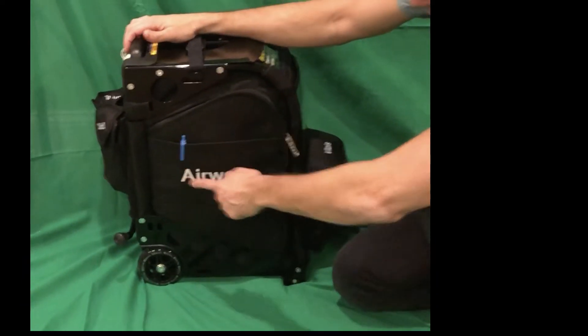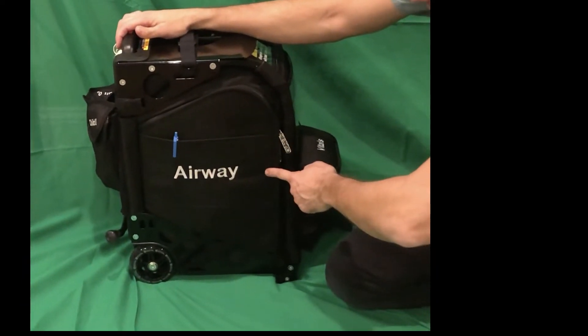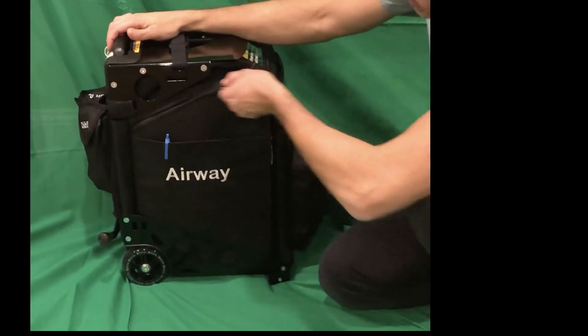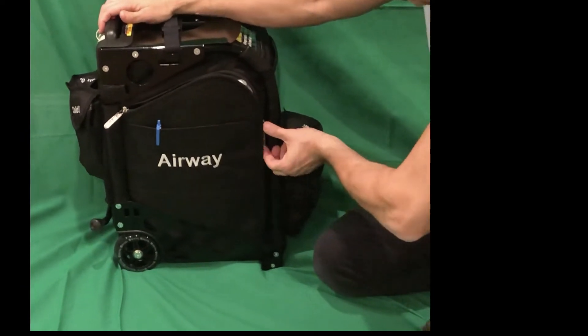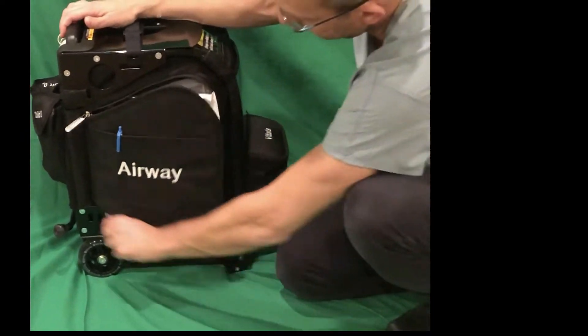The kit has multiple sides. The first side we're going to look at is the side that says airway. If you want any airway equipment, just unzip it.